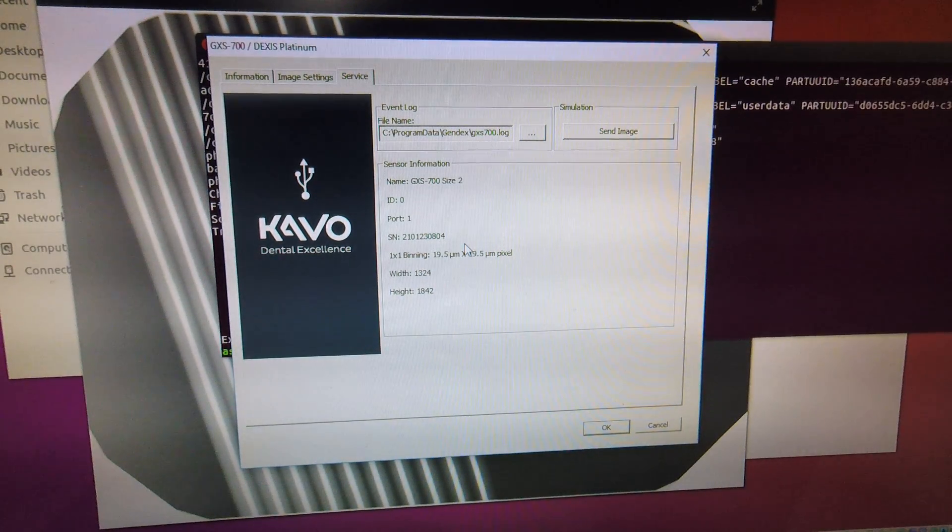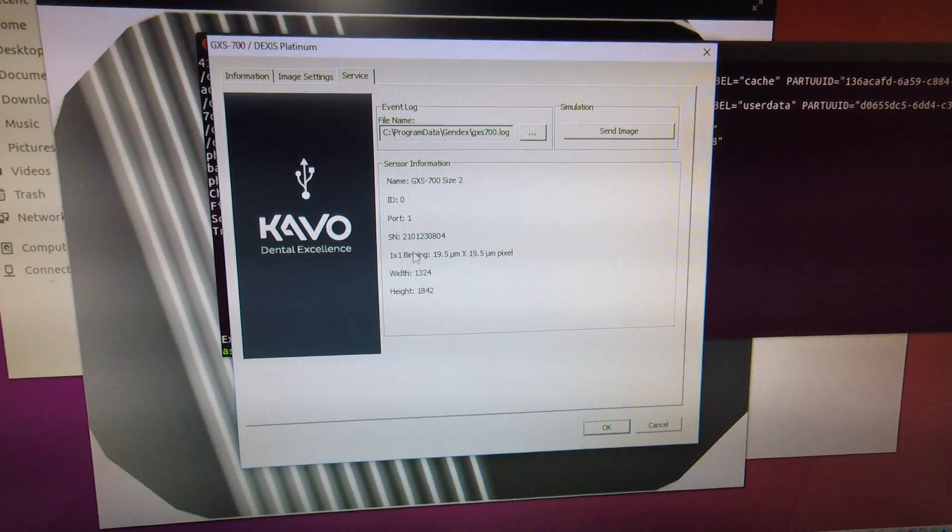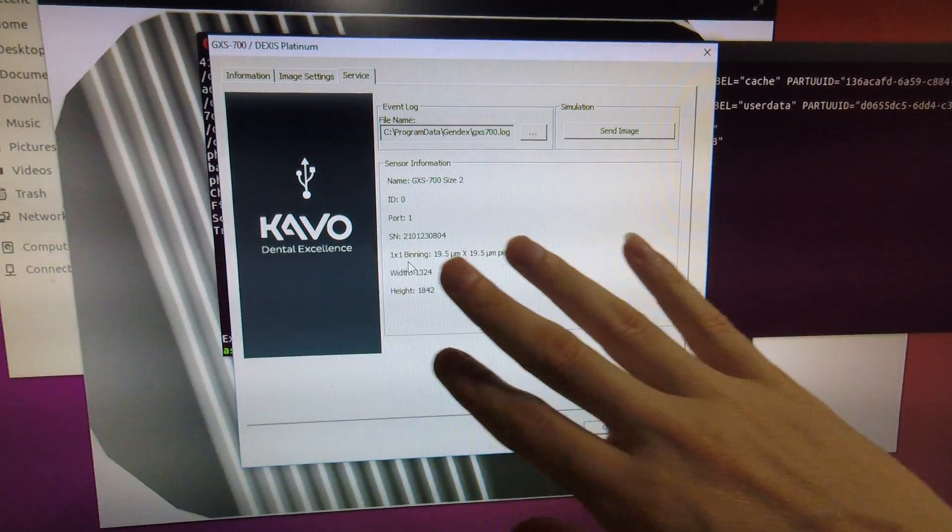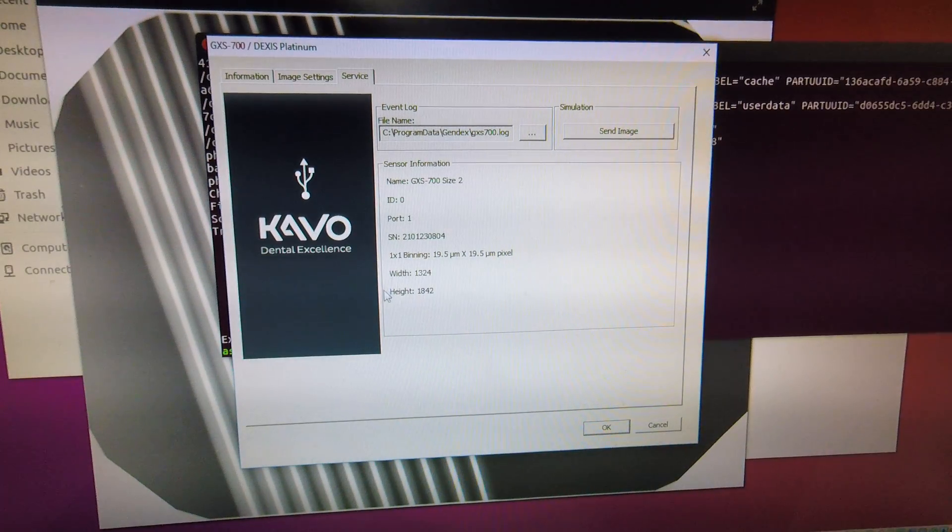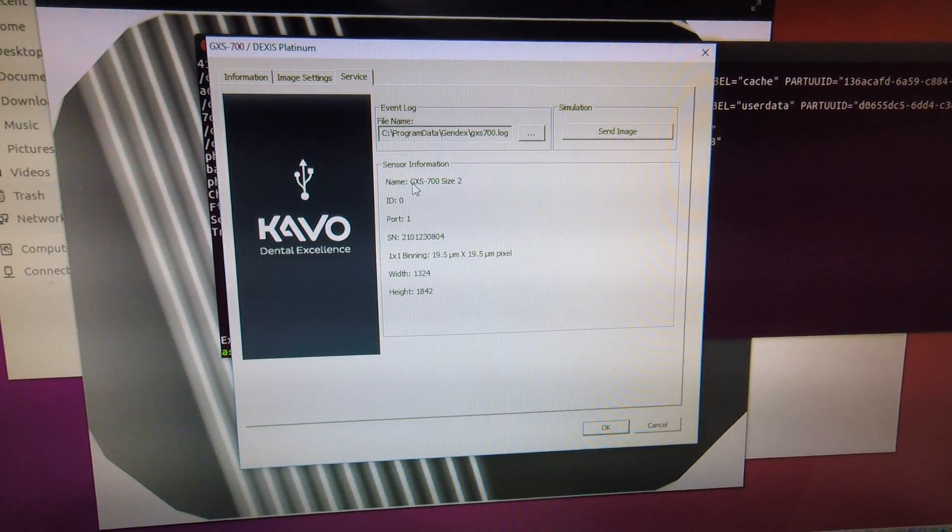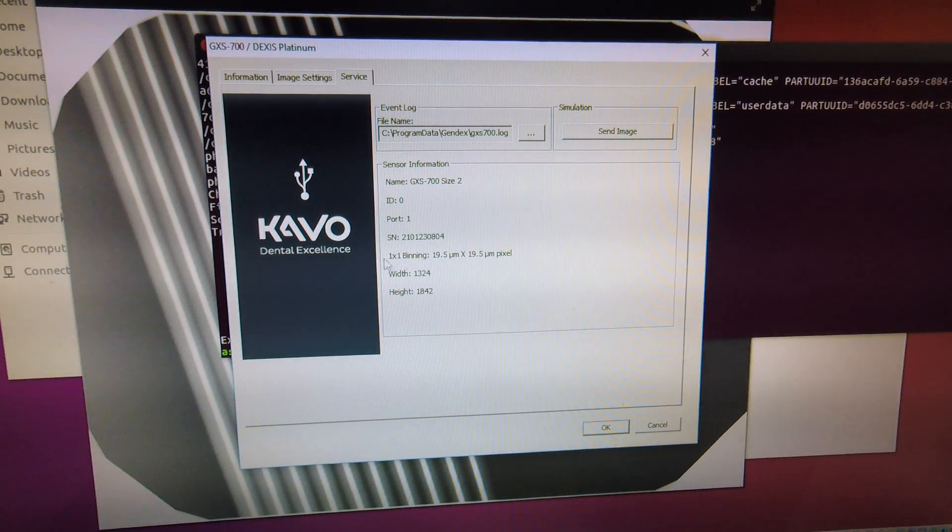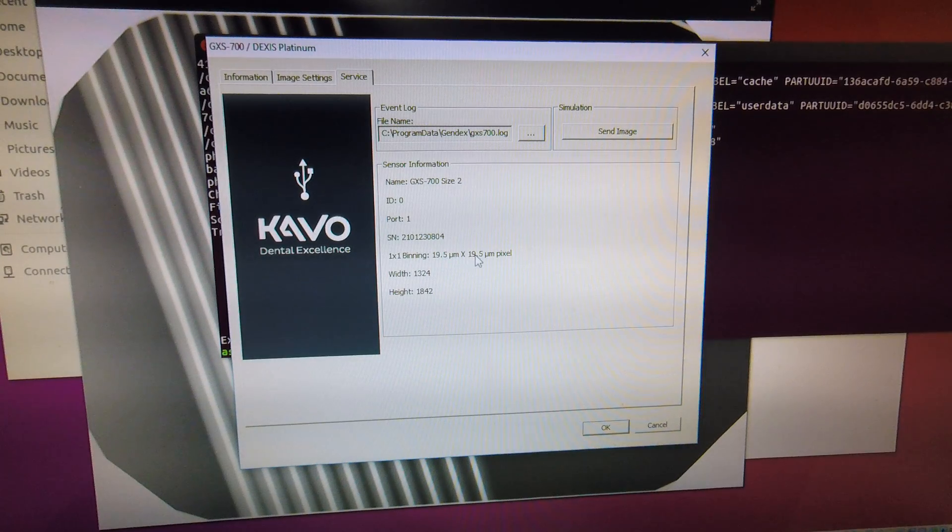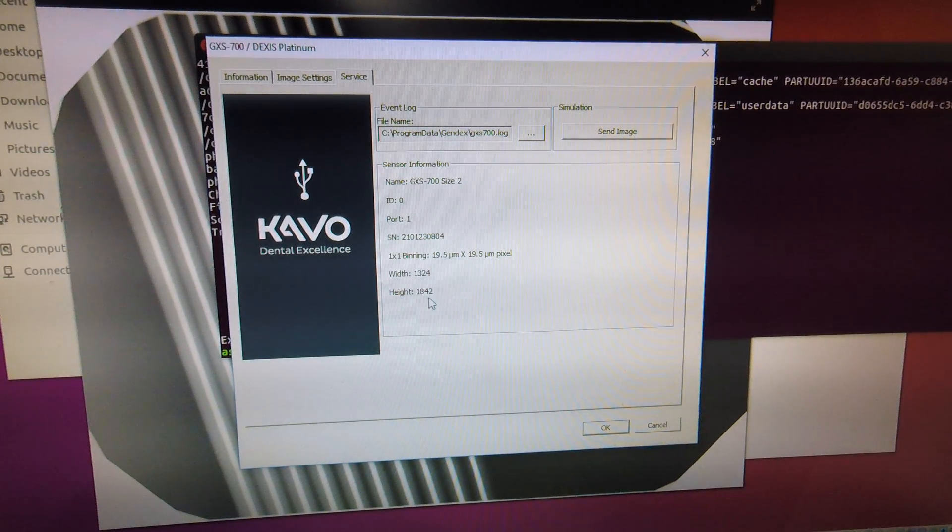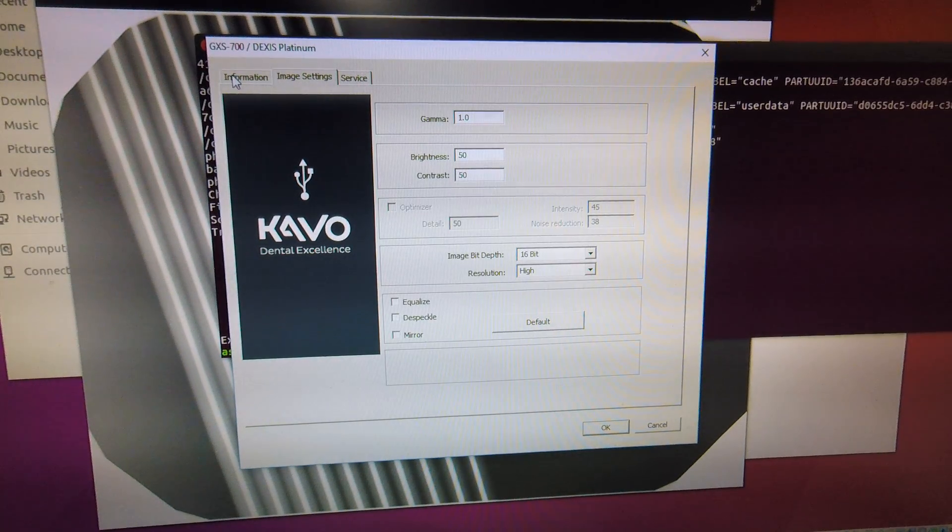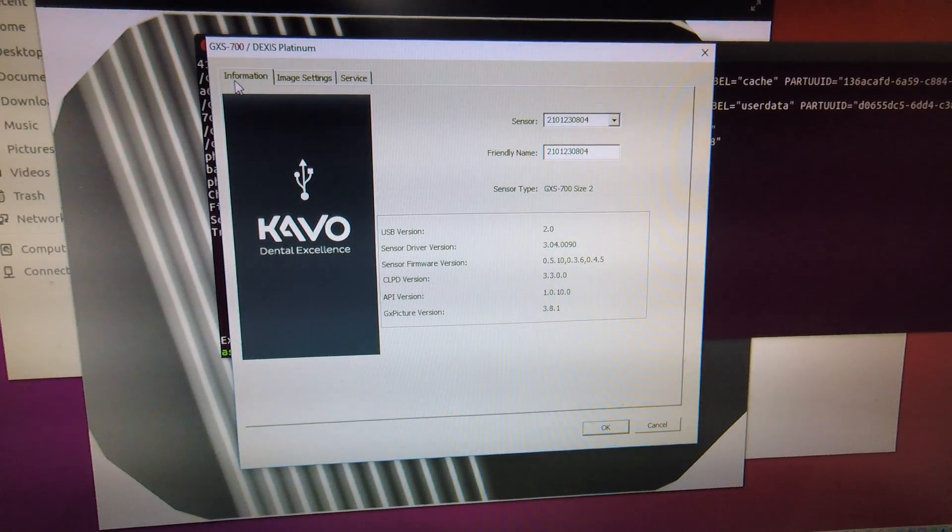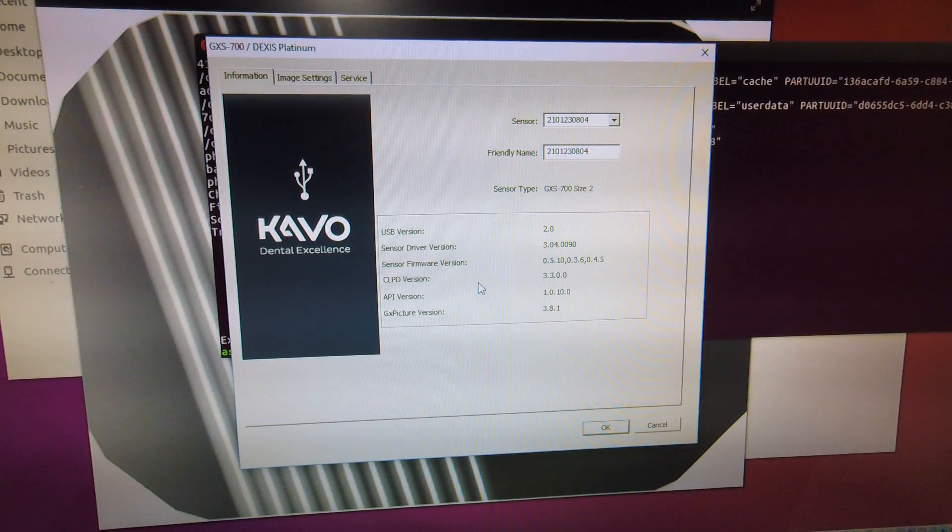Now with the sensor hooked up this is the CAVO drivers for the Gendex sensor. So this is the size 2 of the GSX700 sensor. You can see it's identified as 19.5 micron by 19.5 micron pixels with 1324 by 1842 resolution. And it also has some contrast brightness and sensor information as well as serial number.